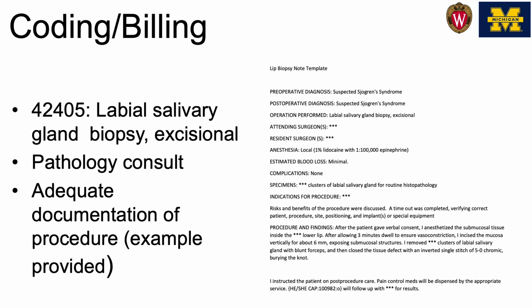And then you'll, of course, need to document the procedure. And we have an example of the documentation to the right. And of course, this could be edited as per your particular institution.